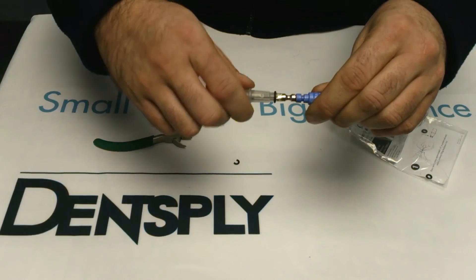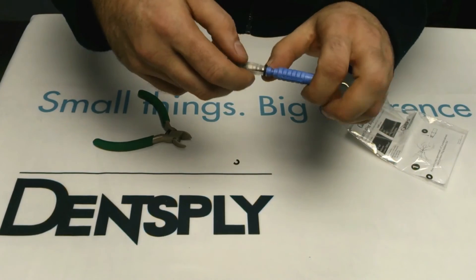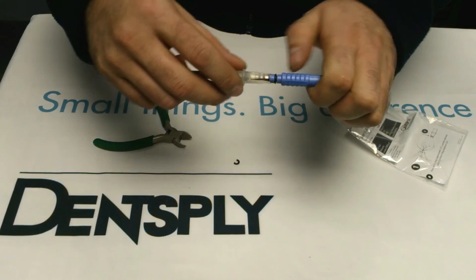Continue to slide the o-ring all the way down until it's just before the annular on the insert, and then using your fingers gently slide the o-ring into position.